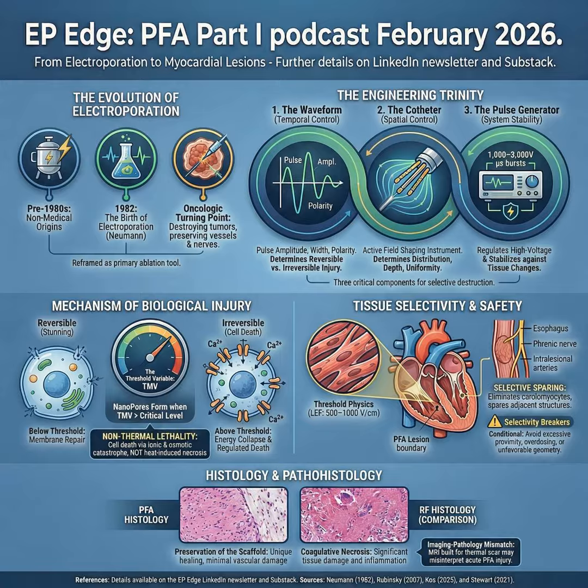That era clarified two ideas that still matter for PFA today. First, electroporation is parameter dependent. Amplitude, pulse width, number of pulses, repetition rate, these define the biological outcome. Second, thresholds exist. Below a certain threshold, the membrane reseals. Above it, you transition toward irreversible injury.